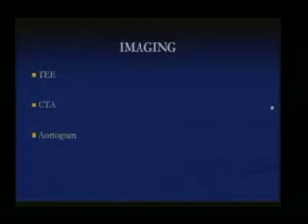TEE can be done at the bedside. It is fast, but it all depends. When you call cardiology, they can come and do it. So I think that's the rate limiting step in our hospital. TEE at the bedside is relatively fast, but it's operator dependent. Sometimes the body habitus of the patient also matters, and whether the patients are intubated or not intubated. But if the patient cannot go for a CT scan, then I would prefer to get a TEE.